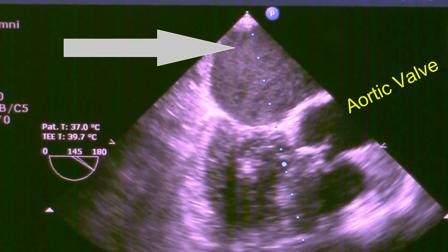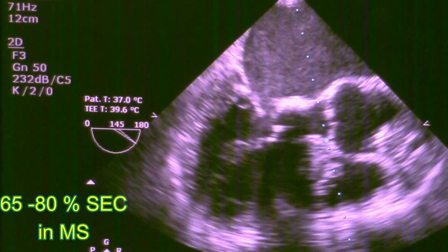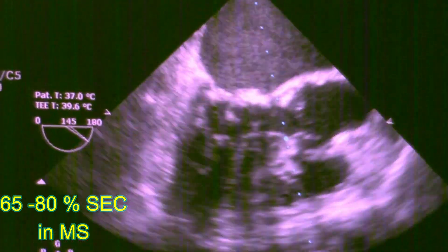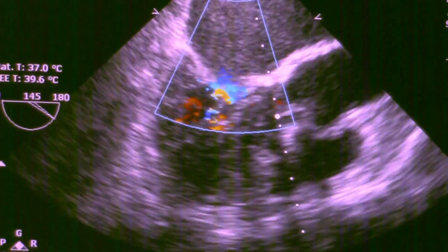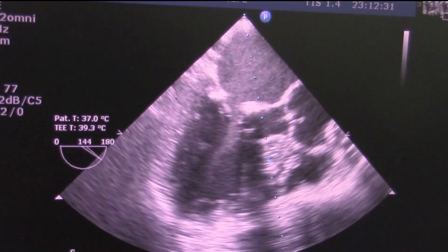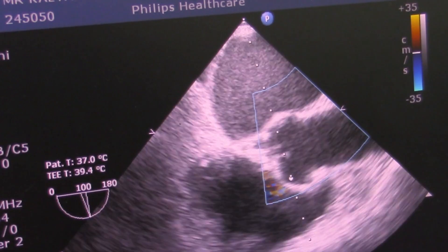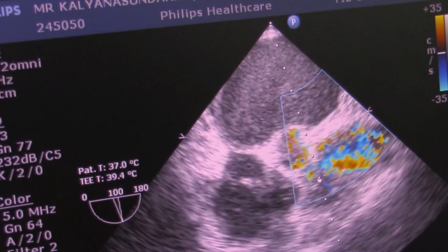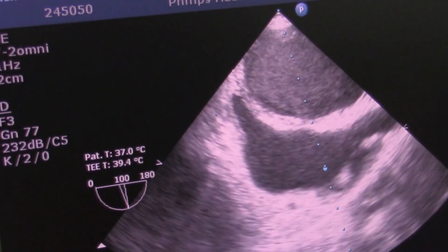This swirling of blood is said to be because of aggregation of red cells. There is increased fibrinogen in patients with left atrial spontaneous echo contrast. Fibrinogen, being positively charged, tends to bind negatively charged red cells, and these droplets tend to reflect ultrasonically as swirling of blood within the left atrium.